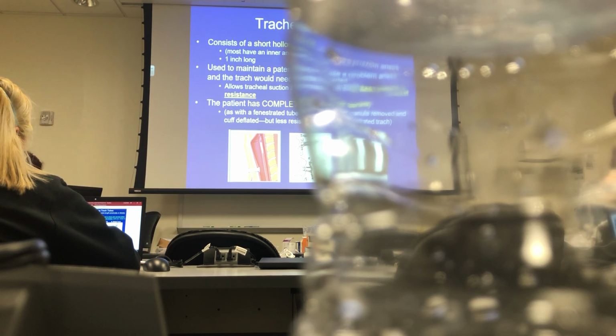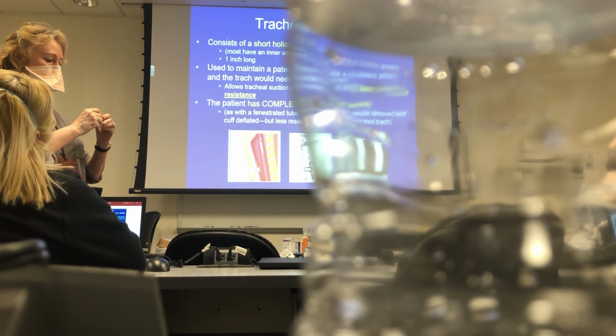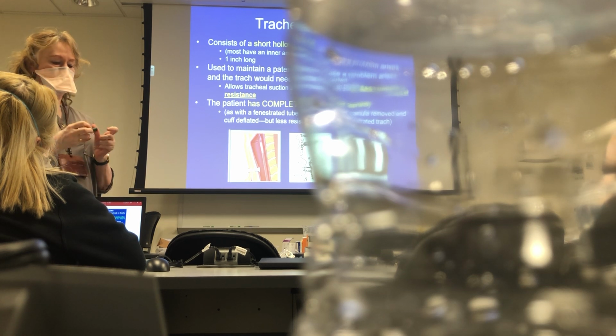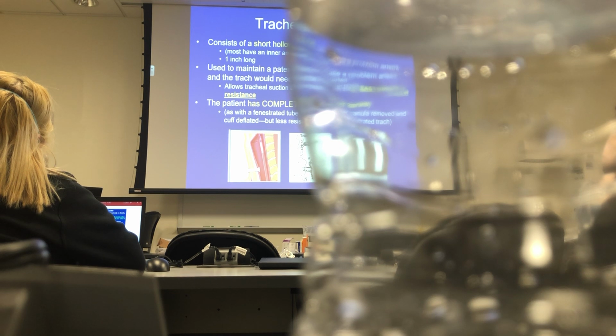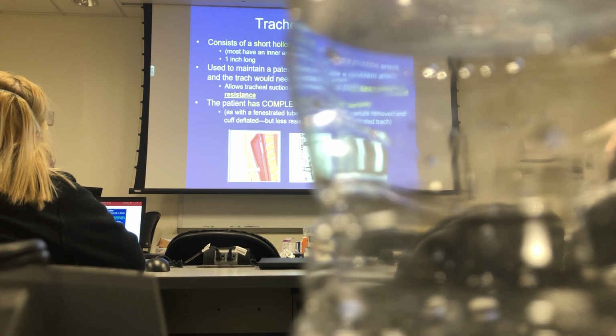So you would measure that. In other words, this goes in, okay? What you need to do is measure how far. So it would go in, here's my trachea. This goes in and hits the wall of the trachea, gets caught on the wall of the trachea. This goes against the outside skin. So you're measuring what's in the patient from here to here. Okay, everybody got that? This cap can be taken off and you can suction through there if you need to.